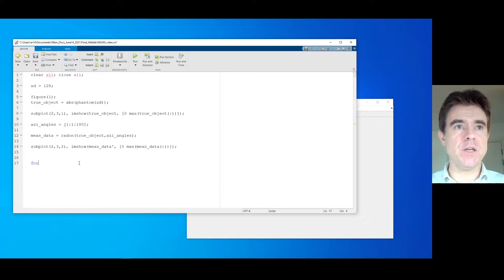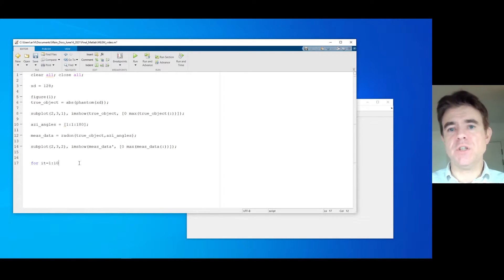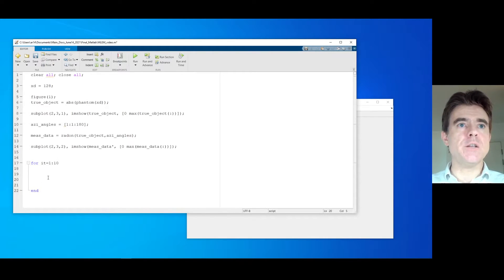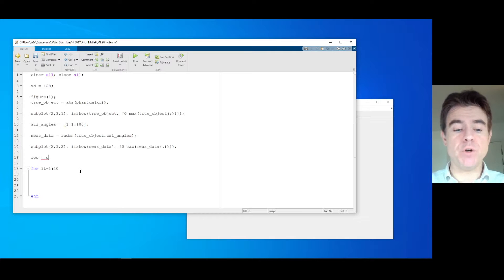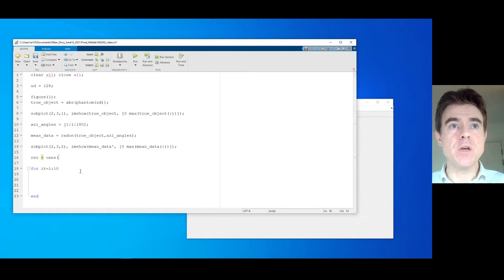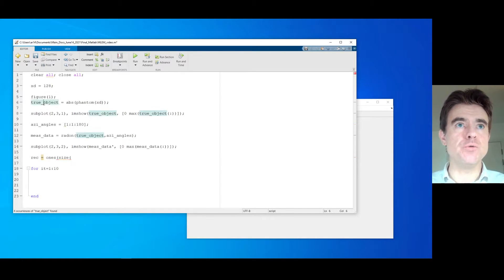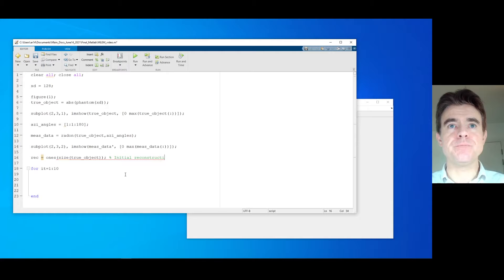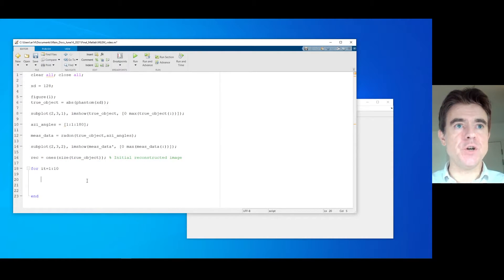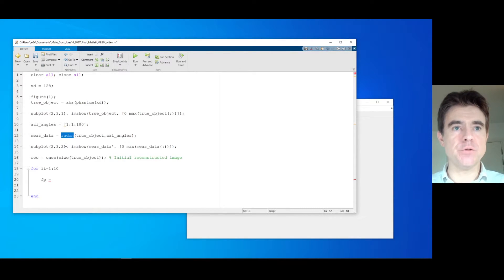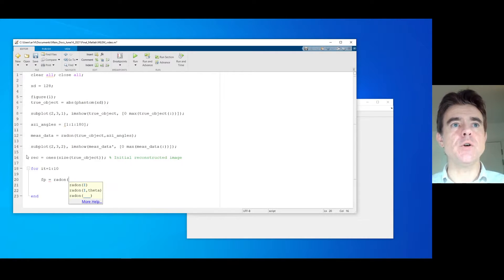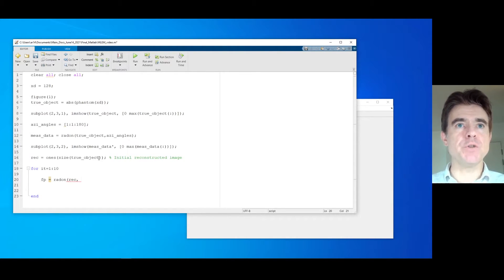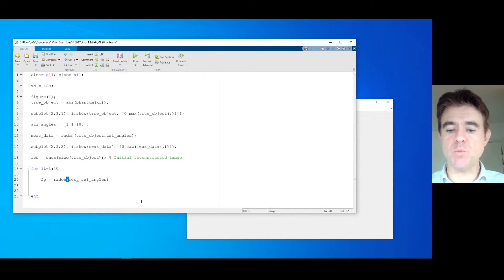What we're going to do then is set up an iterative loop — for iteration between one and say 10 iterations. The basic idea is that I'm going to start off with a reconstructed image which initially is just a value of one everywhere — in MATLAB we'll use ones, making it the same size as the true object. That's my initial reconstructed image. Then we're going to forward project that using the Radon transform operating on that reconstructed image, again into those azimuthal angles between one and 180 degrees.